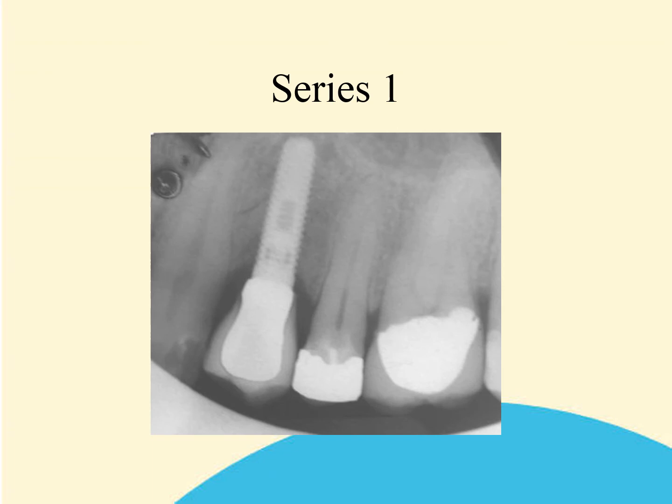Now, in an ideal world, the patient should have the batch number and definite identification of the implant type and series, or even the implant manufacturer. This often does not happen, so we are reliant on radiographs. Radiograph features are almost 80% correct, however, they can be misleading and difficult to read.